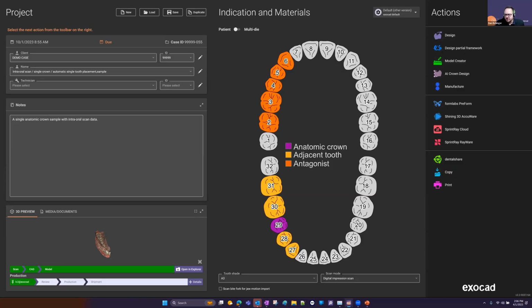Can I change the screw channel diameter on an implant library proposed crown? That's kind of a little out of scope. Most of those are defined by the implant manufacturer. All of our libraries typically come from manufacturers like Straumann, Nobel, or Argen, all the implant manufacturers out there that have libraries with us. They're provided from the manufacturer, and we just ensure that we meet FDA guidelines.